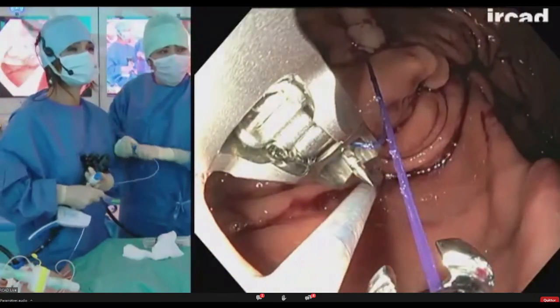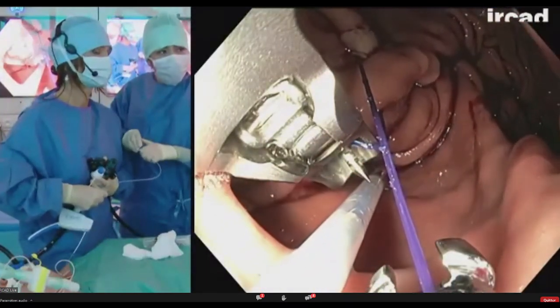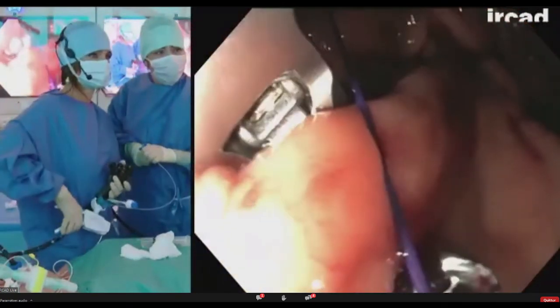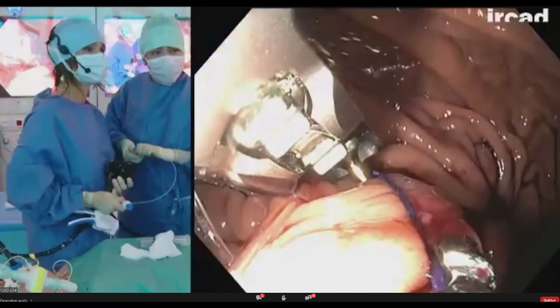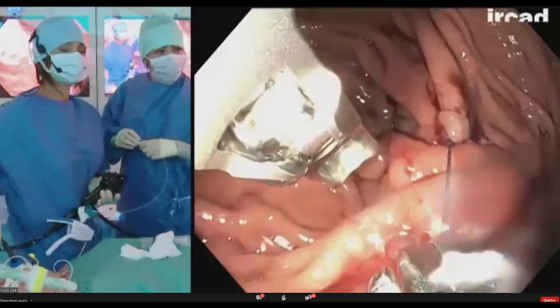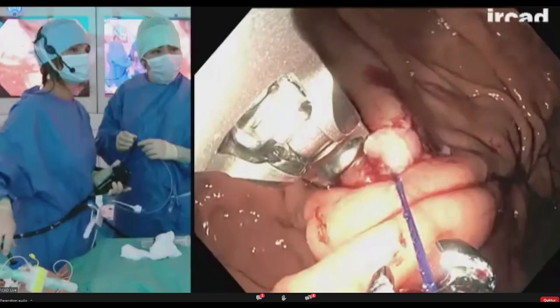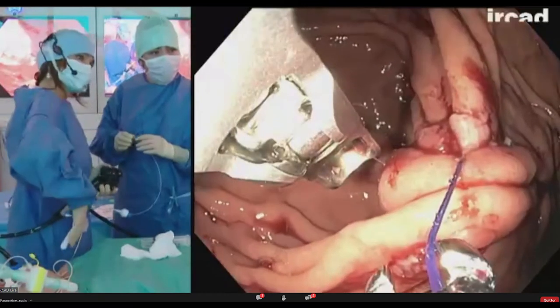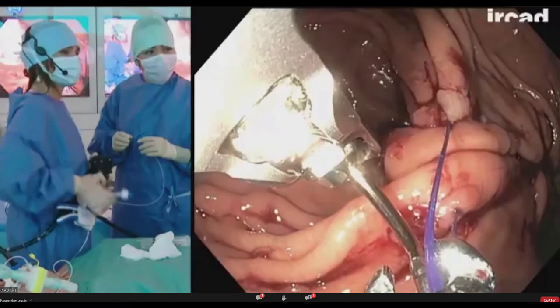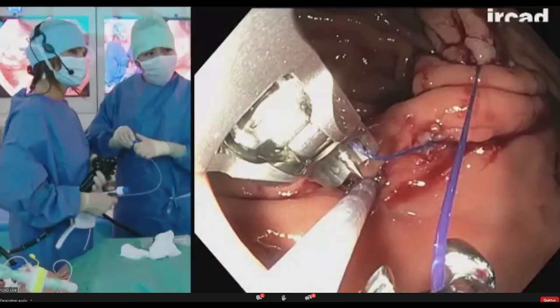Yeah. I think in the United States as well, it's not very common to resuture, but it's more because of reimbursement issues. The device is rather expensive and we'd have to apply for a pre-authorization, et cetera. So most patients in the United States don't get resutured. Instead, if they did well following the endo sleeve, they would be referred for surgery if they regain their weight. If they didn't do well, they'd be referred for medical treatment.